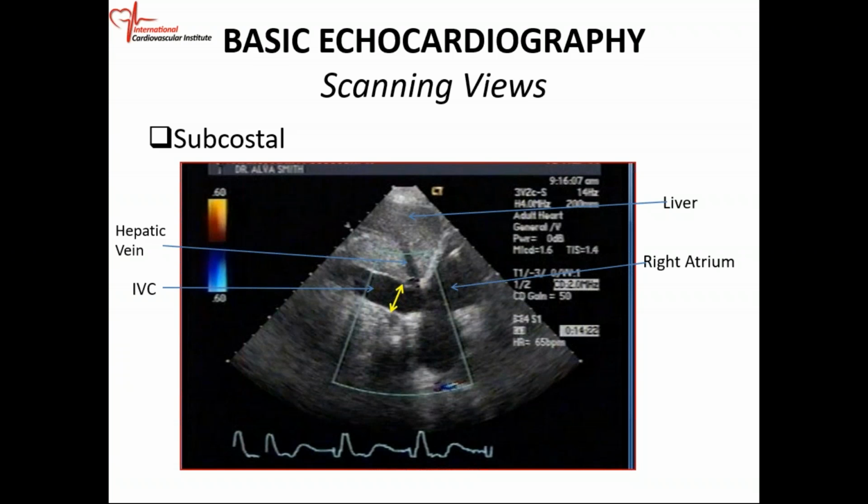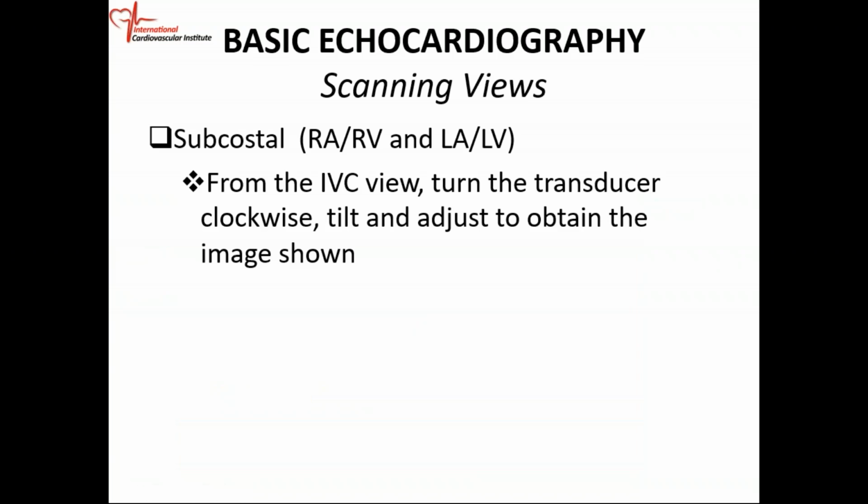and measuring the width of the inferior vena cava is very important. So you usually measure it just before where the hepatic vein enters the IVC right there. So measuring the width of it is important.